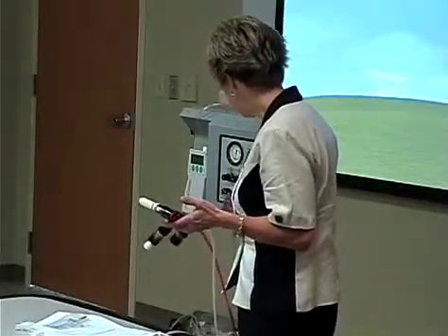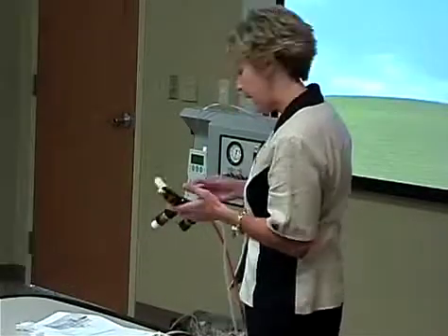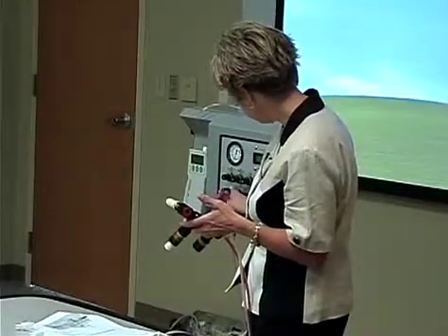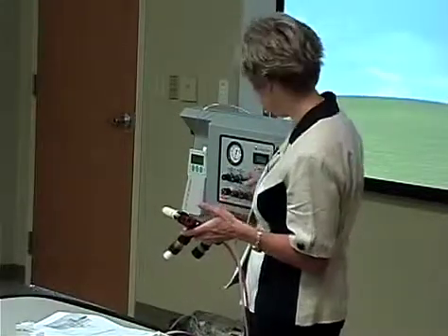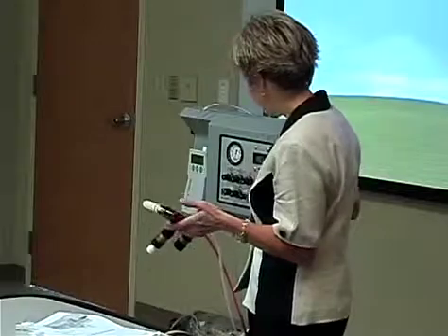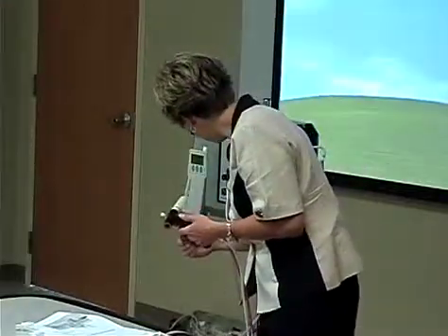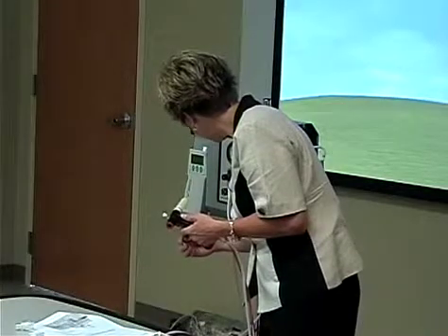So I've increased my flow, I'm increasing my hertz, or increasing my rate. If I don't have amplitude, like I said, this may not read out. It's reading out actually. Last night it wasn't. So increase my flow, got my hertz about 8, which is 480. And now I'm going to set my mean. And it's already at 10, so I'm going to start at 10 if we think his mean is 12 right now.